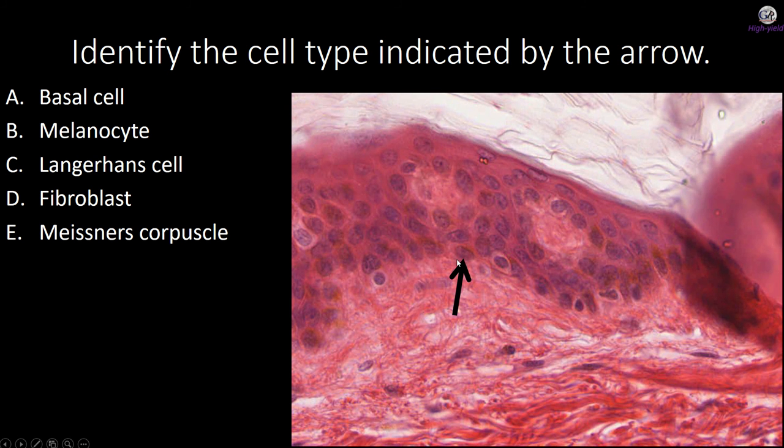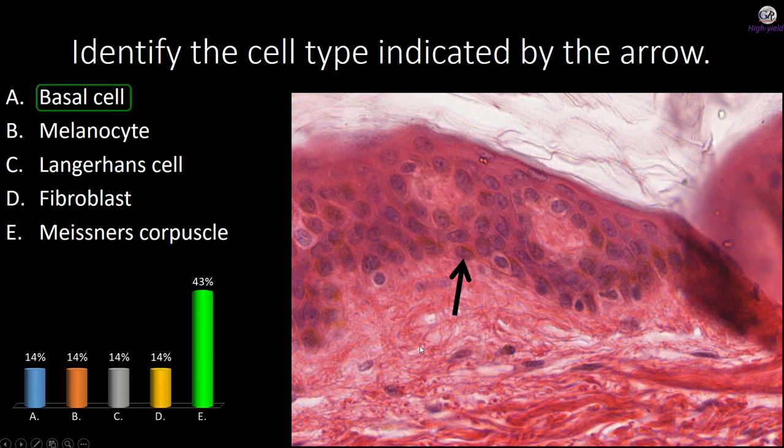So this is a basal cell, right? It looks like a round cell. Cytoplasm is not pale like this one though. So it looks like kind of all these cells. Oh, I think this is just a basal cell. And that's what it is. So here you can see a melanocyte with the pale staining cytoplasm. Here's another melanocyte, here's a melanocyte.